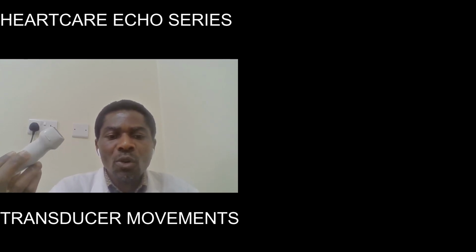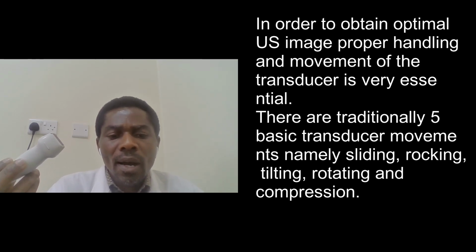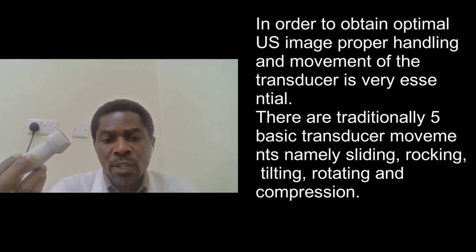In this video, we are going to discuss transducer movements and manipulation. In order to obtain optimal ultrasound image, proper handling and movement of ultrasound transducer is very essential.